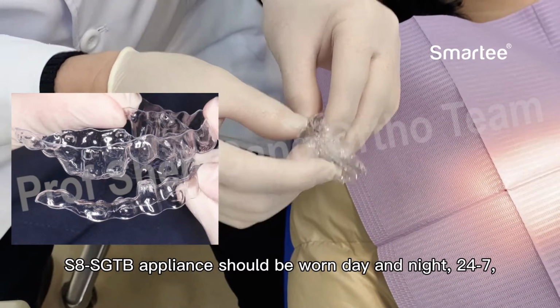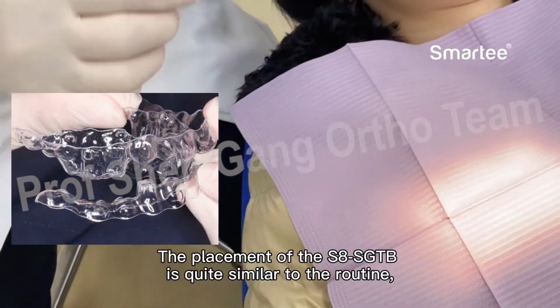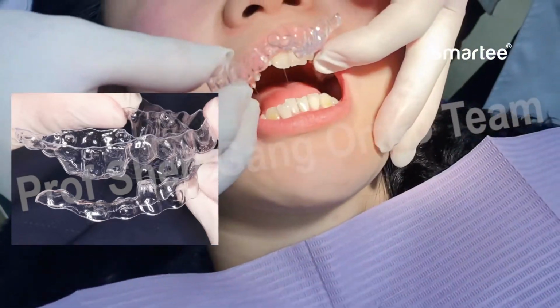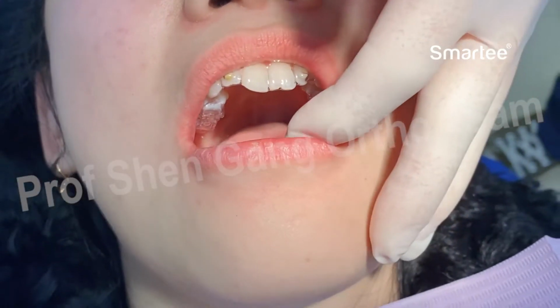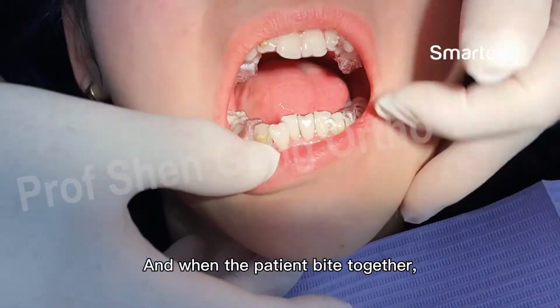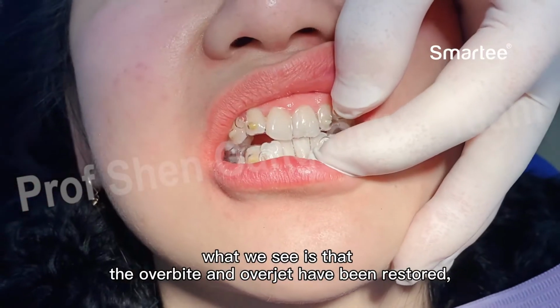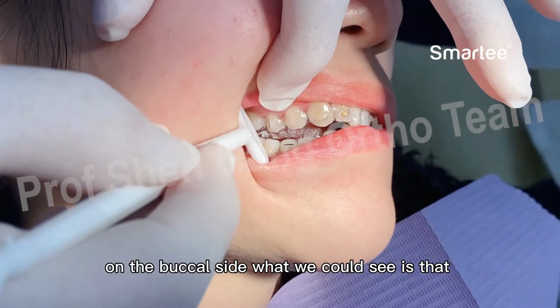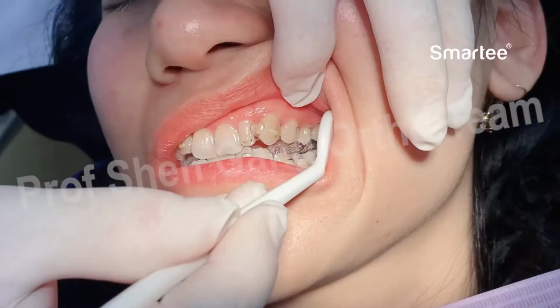This appliance should be worn day and night, 24/7, including mealtime. The placement of the S8 SGTB is quite similar to the routine. We have the upper piece of the appliance placed onto the upper dentition, followed by the lower one. Then when the patient bites together, we see that the overbite and overjet have been restored. On the buccal side, we can see an occlusal splint placed between the upper and the lower dentition. That's it.